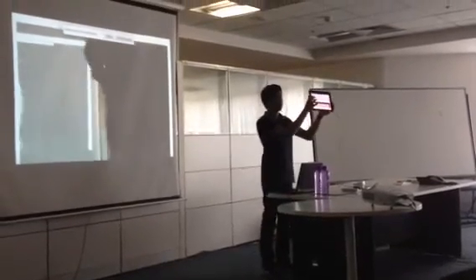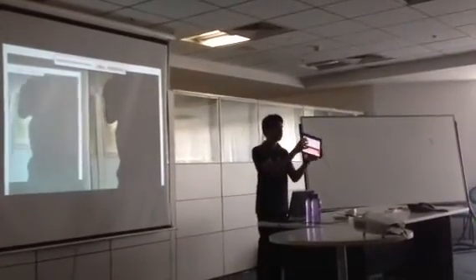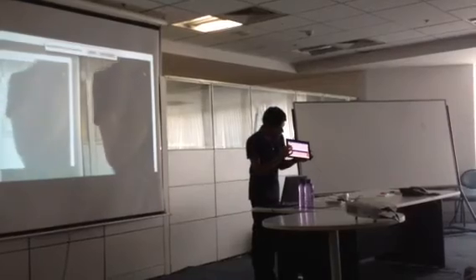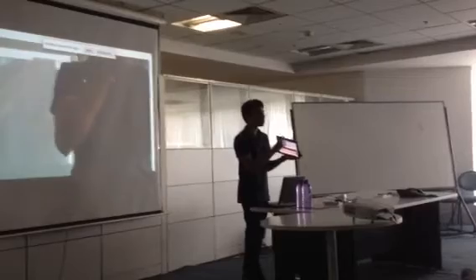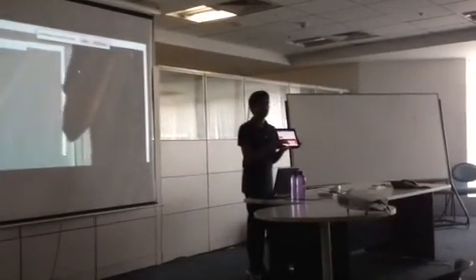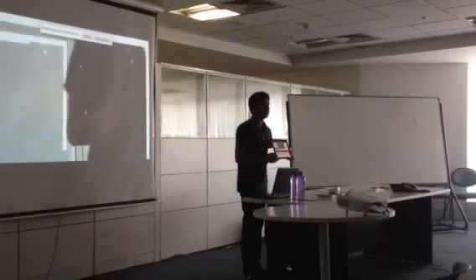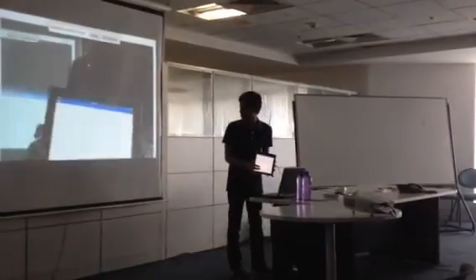So this card right here represents the basic patient information. Exactly what you saw on the screen before, you can see here again, just as a reference. The bottom part gives you the test name, and the top part gives you the patient age and name. This part is the test results. As soon as you click on an open report, you can view the results. This represents the table of genes and variations that are in the report. Pressing the gene name will give you information about the gene itself. Pressing on a report, or sorry, variation.